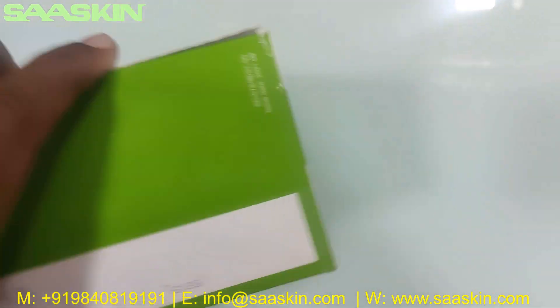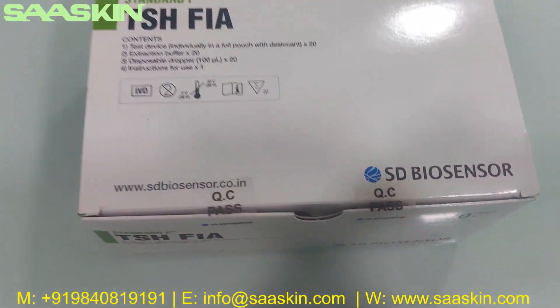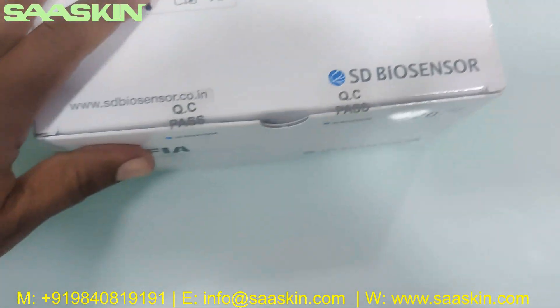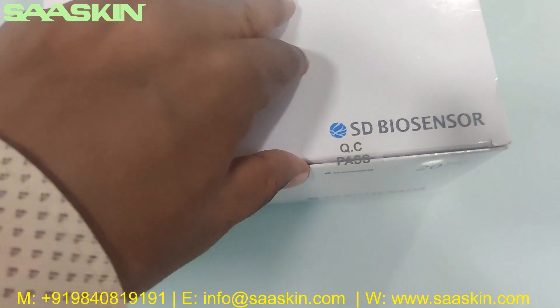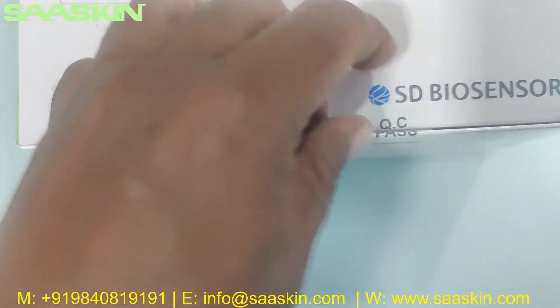This is how the total test kit box looks like. Let me unbox this for you. There's a QC sticker here, let me remove this sticker.